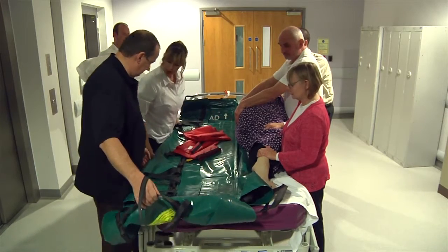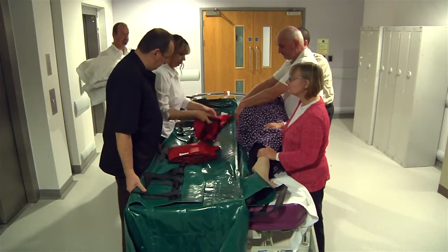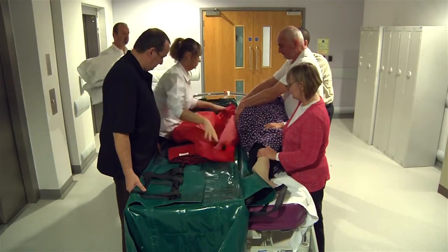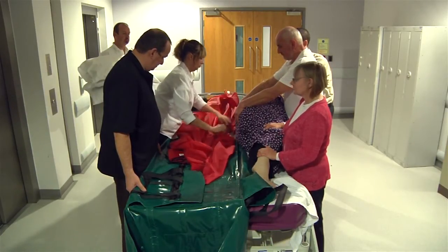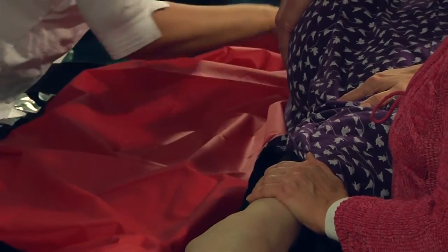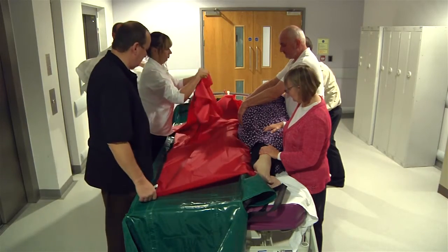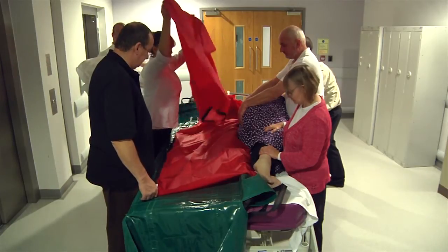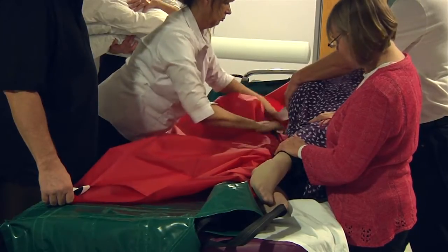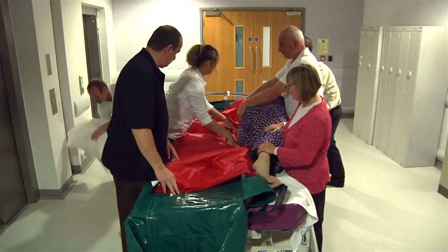The patient will then need to be transferred onto the evac mat, either on the bed or on the floor, by safe means using approved moving and handling techniques suggested by the qualified personnel who are available at the time of evacuation. Slide sheets can be used if available. It may be useful to have bariatric slide sheets stored with or close to the evac mat. Roll them back onto the evac mat.